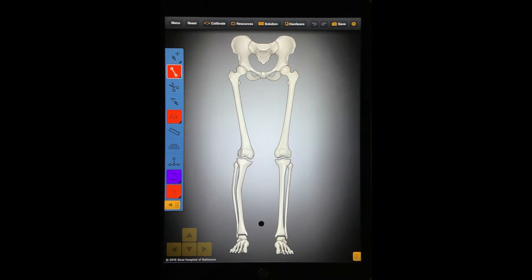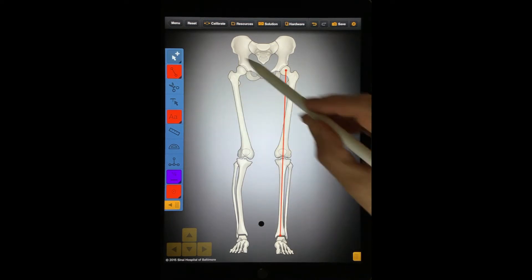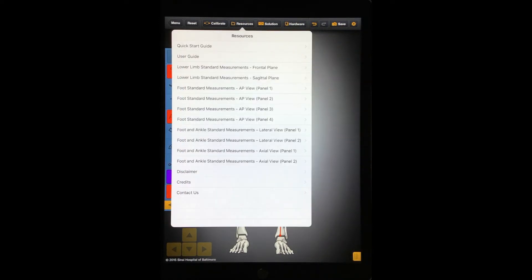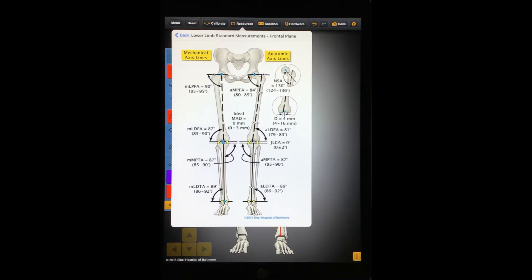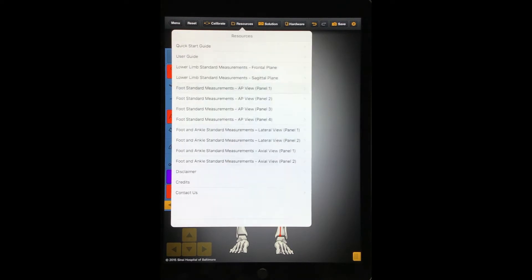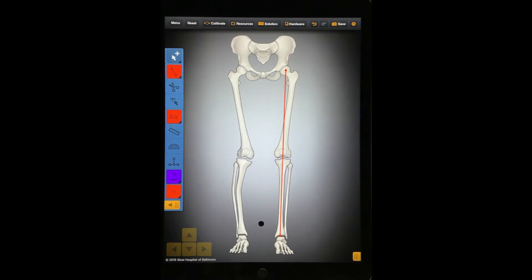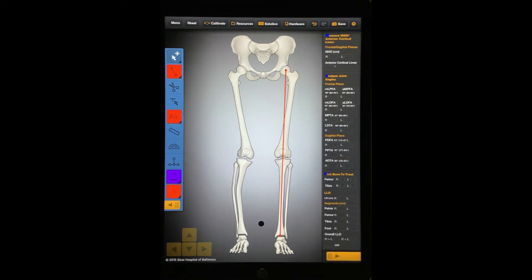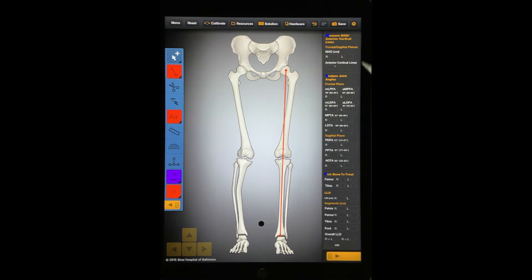We recommend that all your X-rays contain magnification markers. Now, when you draw a line and then select it, the length appears at the top. Press the Resource button to see additional resources, including the Quick Start Guide, User's Guide, Standard Measurements of the Lower Limb, and Standard Measurements of the Foot. The left-hand side of the screen has the Deformity Correction toolbar. This toolbar can be hidden or unhidden when you press the orange tab at the bottom. The right-hand side of the screen has a chart with standard measurements.